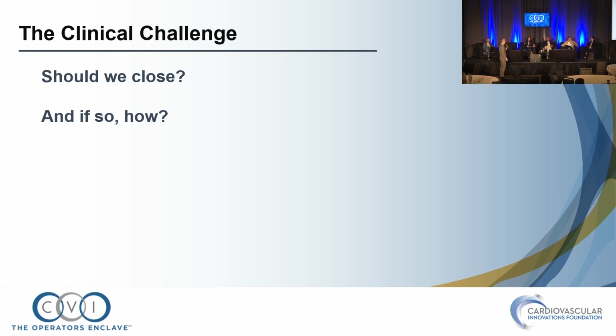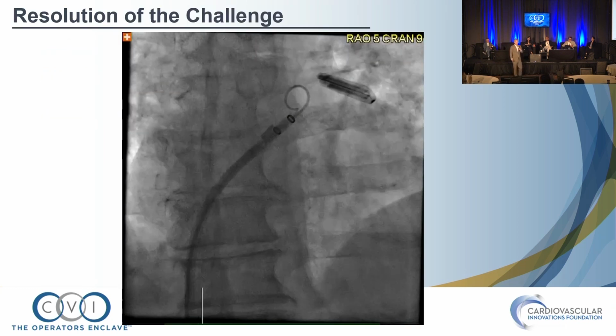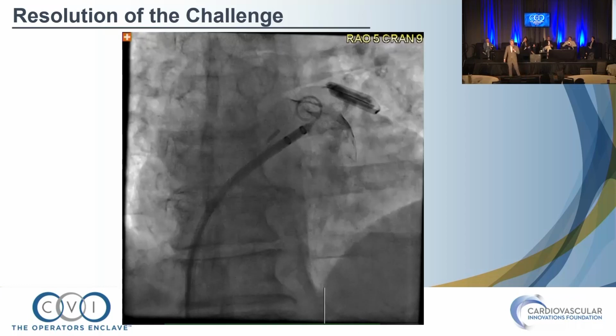Well, I would say with the atrial clip, it's a good procedure, I think, if the surgeon's very diligent. The surgeon who did this case is very meticulous. But sometimes there is epicardial fat that they just cannot pick away. They just can't get to the ostium to put that clip down. And so you're left with a pouch. And this is what it looks like on angiography.